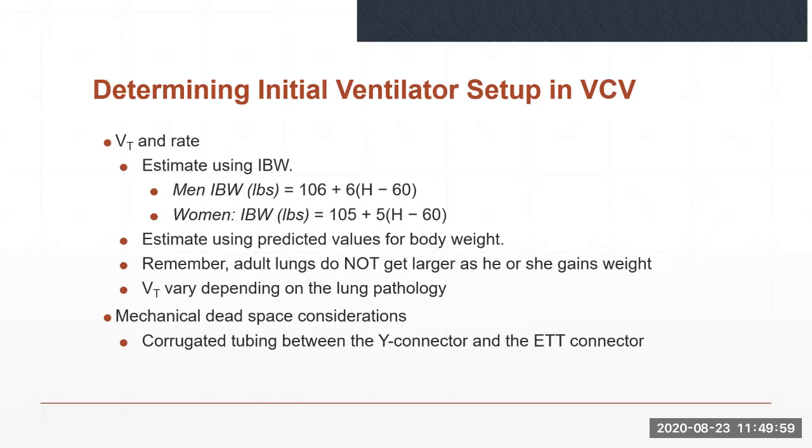A tidal volume of more than 9 to 10 mL per kilo is not recommended because of the risk of high pressures and accompanying overdistension and trauma to the lung, in addition to other complications. Low volume settings, such as 4 to 8 mL per kilo, are beneficial in restrictive diseases and may help prevent high pressures and alveolar overdistension.